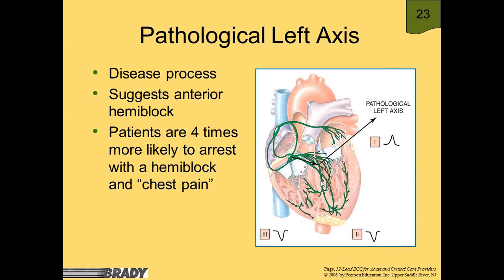Okay, it's through the ventricles, not even coming down to lead 2, but it's going strictly to lead 1. So we're going to see a negative in 3, negative in 2, positive in 1. So that tells us the only direction that this electricity is passing is up into that left arm lead. Okay, so it's going up.